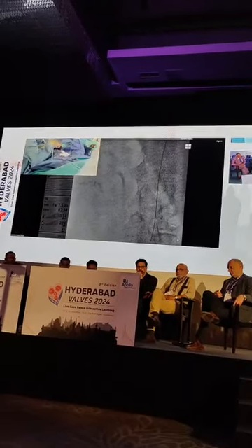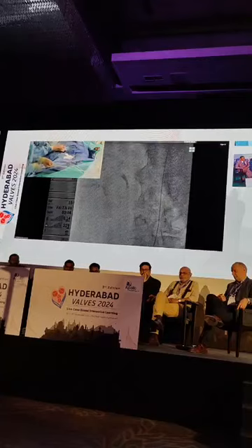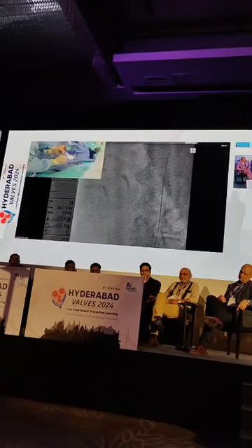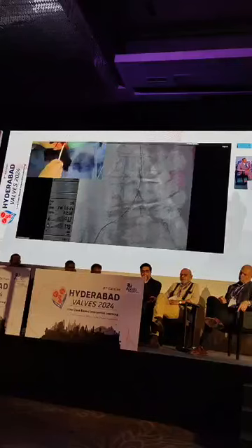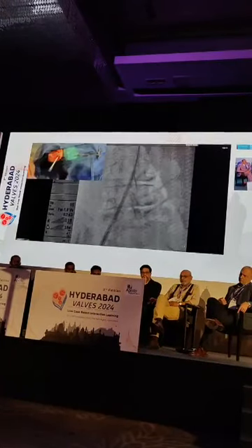We advance the dilator of the 14 French introducer. In fact, it's not absolutely mandatory to use it as a dilator. But why do we use it? Because we prefer to exchange the wire, placing an extra stiff wire instead of a regular 0.035 wire.